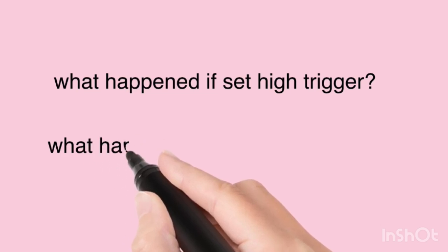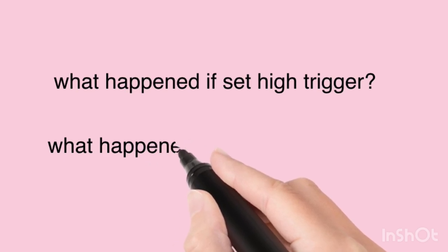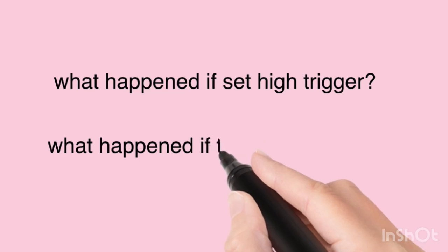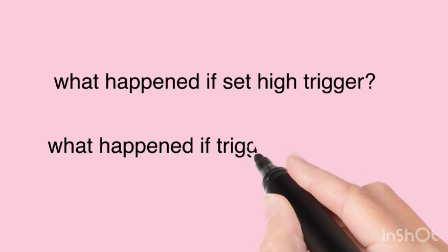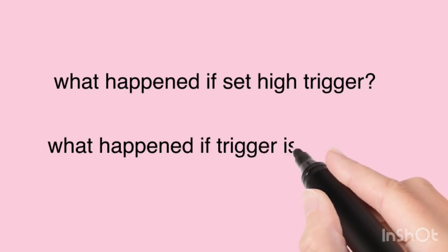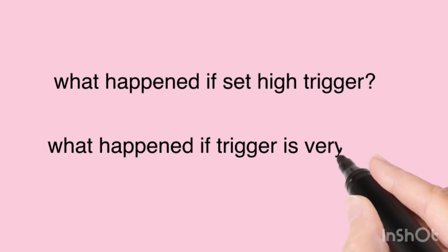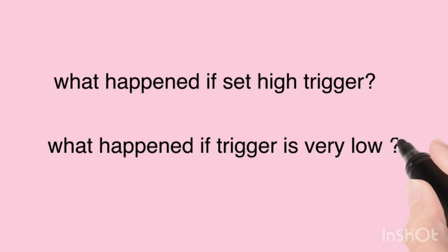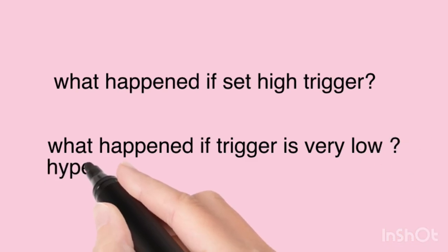What happens if we put the trigger very low, like 0, less than 2? Then even with a flicker of movement, when the patient is not generating a breath, the ventilator will be triggered, thinking he is trying to get a breath, so it should support. It will continuously support and the patient will end up hyperventilating. So don't go to either of the extremes. The trigger should be around 2 to 5. I think you are all very clear.